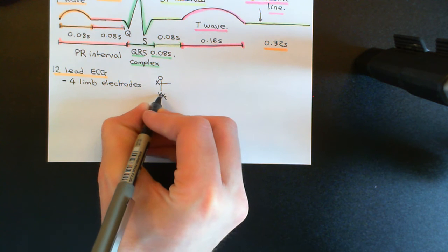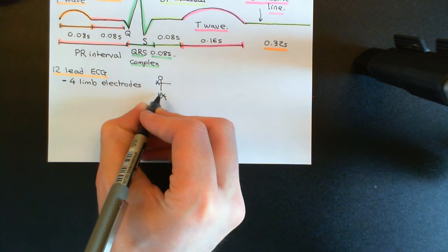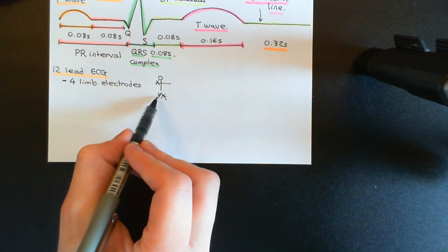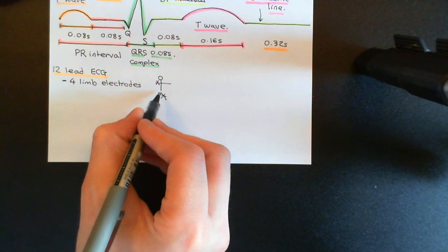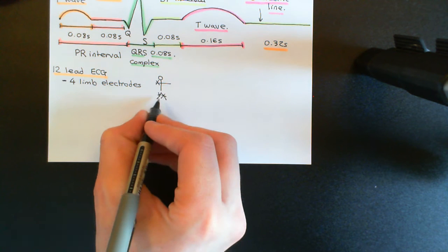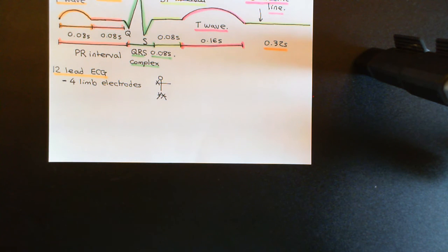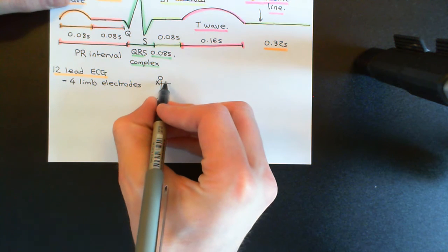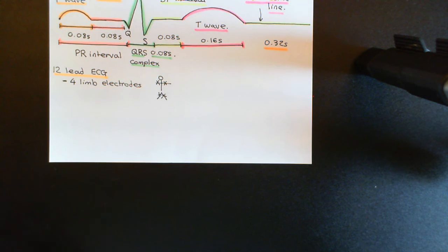We're now going to add 1 onto the right leg, which we'll talk about, the fact that actually we're not going to use this one in any of the leads. That one's there for technical reasons, which I'm not going to pretend to understand, and therefore we're not going to go into. It's for earthing. I don't understand what that actually means, but it's there for technical reasons. And then there's going to be 1 also on the left arm as well.